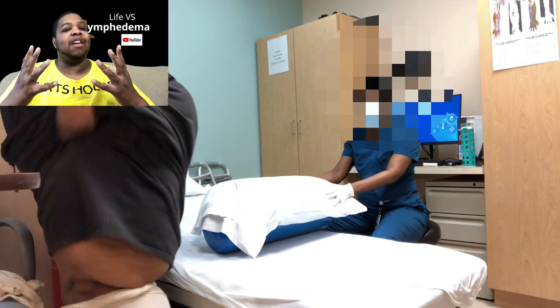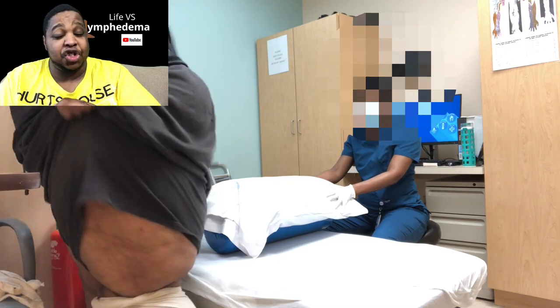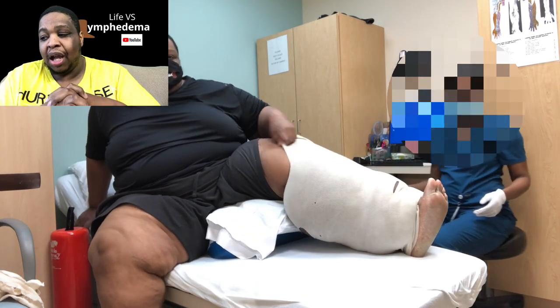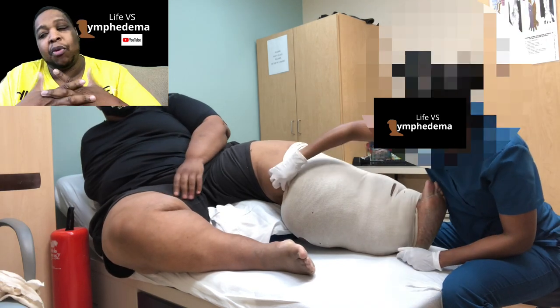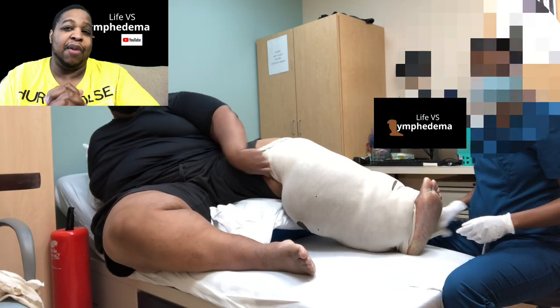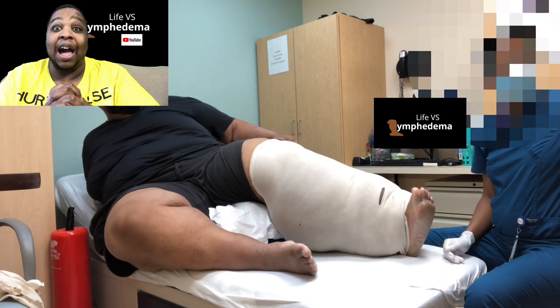What's going on everybody? Welcome back to Life vs. Lymphedema. I am Brian and today we're going to watch George get wrapped. This is my last manual lymphatic wrap session. I'm going to be here throughout giving you my commentary and I'm going to pause when my physical therapist is saying something that people need to hear or whenever we're just having candid conversation. Let's get started.